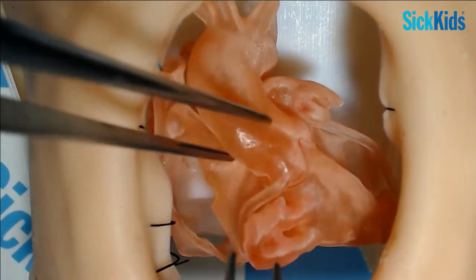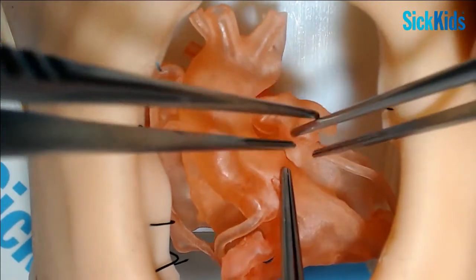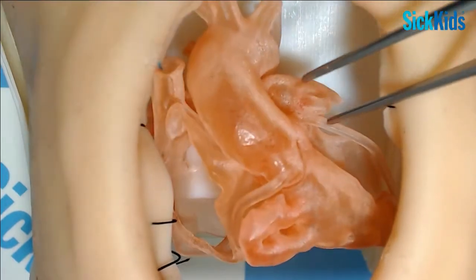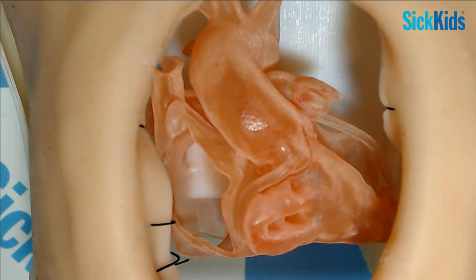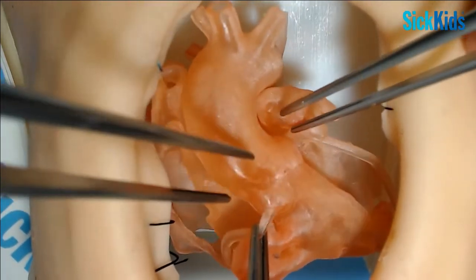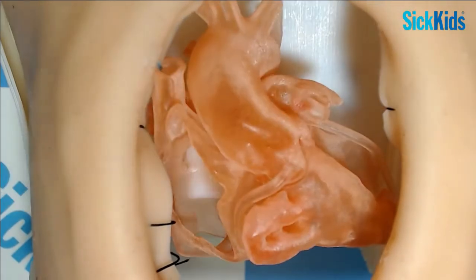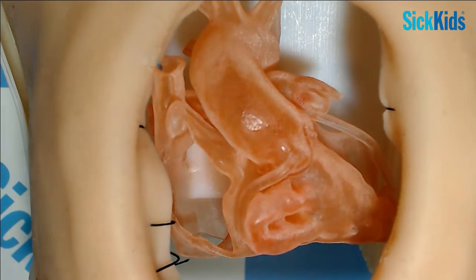So if you look at orientation itself, you've got a nice model, you've got some beautiful coronaries that have been shown. Often they're not that obvious in a truncus. And you have to be aware of the coronaries, because they can be abnormal. The coronary patterns, often they arise a little bit higher up than you expect, and they can arise very close to the commissures and sometimes even be almost kind of intramural in their origin, so you really have to watch them.